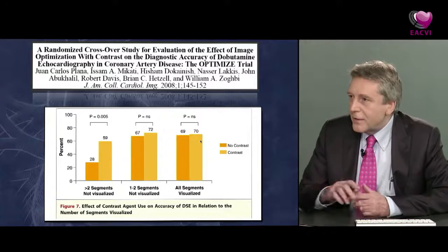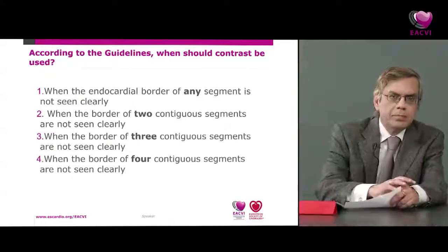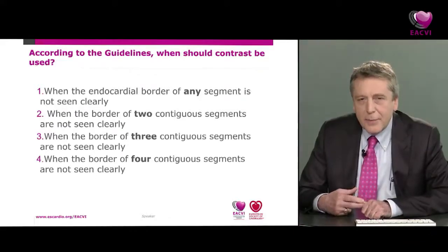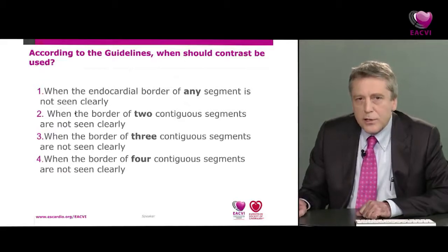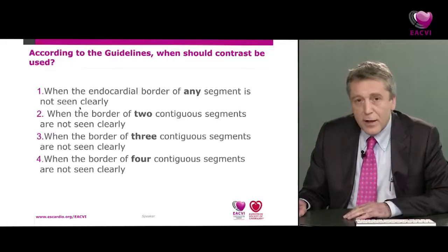Okay, Roxy, I think I've been doing quite a bit of talking now, and I think it's time to let our audience answer some questions. So we've got the first of the multiple choice questions for you to look at, and these take us back to the guidelines, and it's really quite an easy one. So you have the opportunity here, and there's 4 choices. So when should contrast be used in not just a stress echo case, but an LVO case?